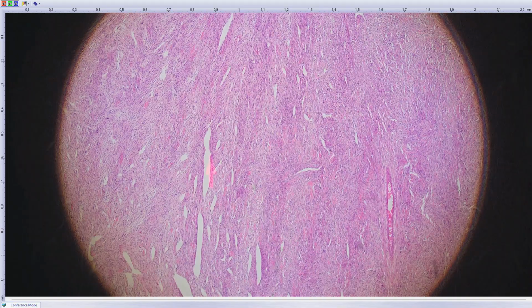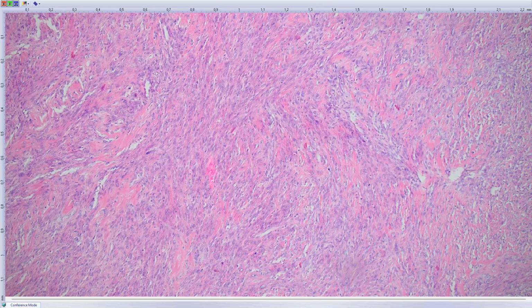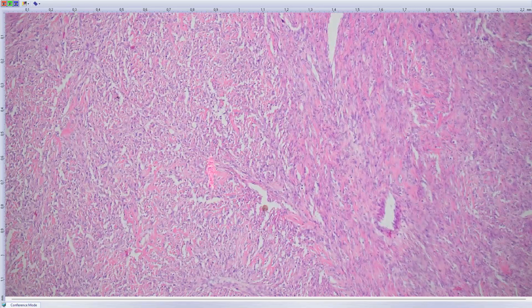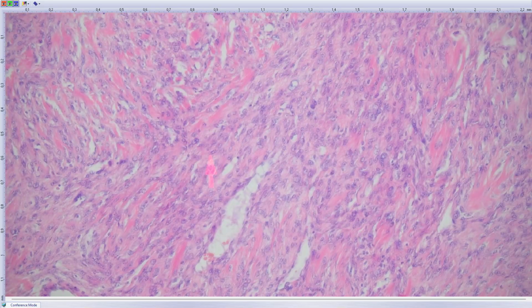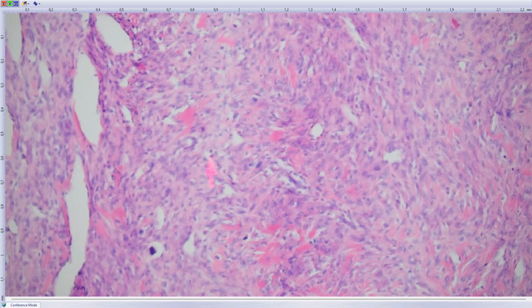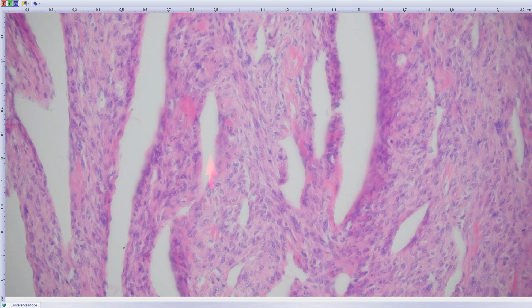So this is the H&E of the submitting institution. It's not very nice, but yeah, giant cells are a useful clue for some tumors, but more often you will see giant cells confusing you. So here it was just a confusing factor. Some dedifferentiated liposarcomas, as well as many other malignant tumors, have a giant cell component, which doesn't mean anything.